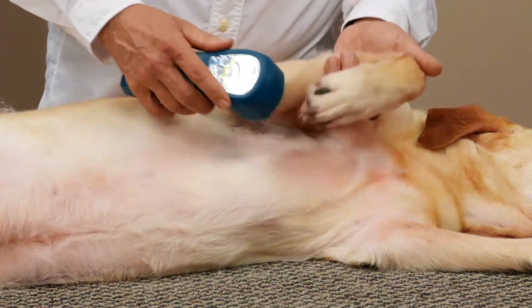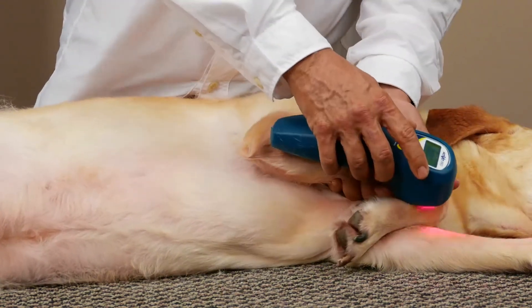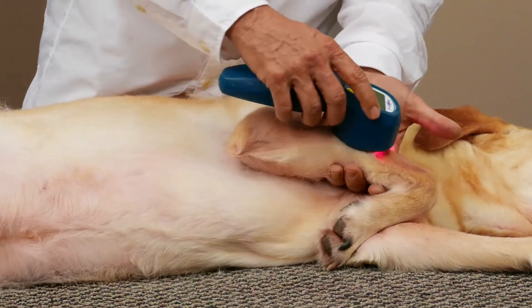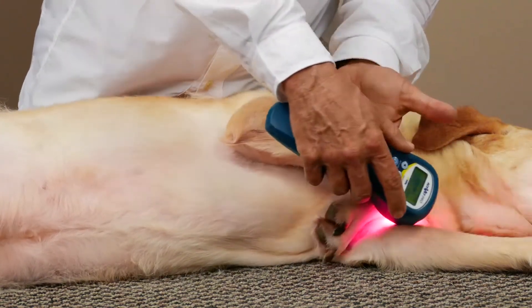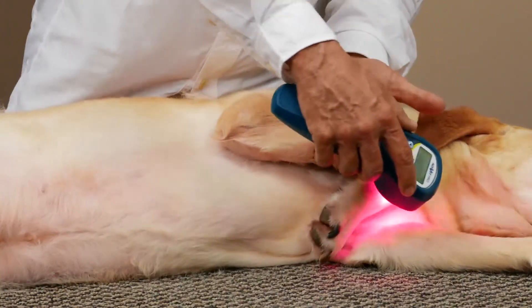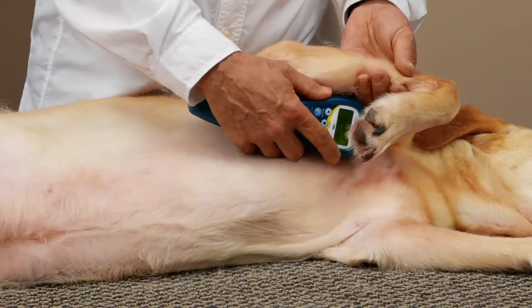Now if it's a traumatic injury, you don't want to put the laser right on the middle of that swelling. You want to work around the periphery of it, so you're opening up those blood vessels and lymph around it to give that drainage a place to go — you don't want to create back pressure. So just around the periphery of the swelling, and then to that proximal lymph node.